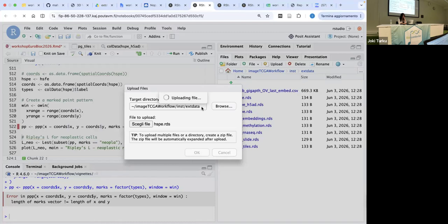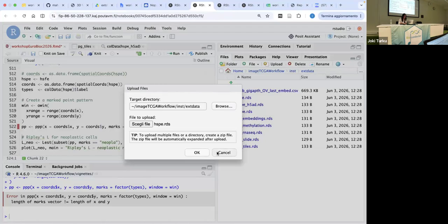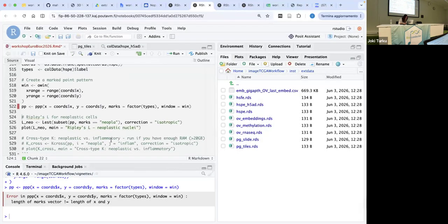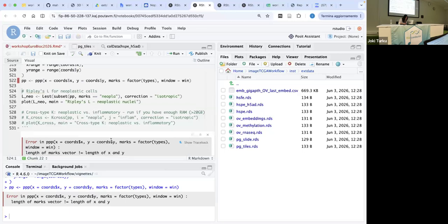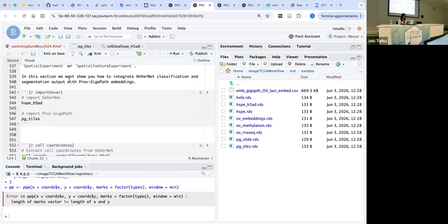No, it takes a while. Yeah, exactly. Yeah, probably yes, but here. Maybe you can refresh the page. If no, it doesn't work. Okay, no, okay. Cancel. Okay, I just, just keep that part.